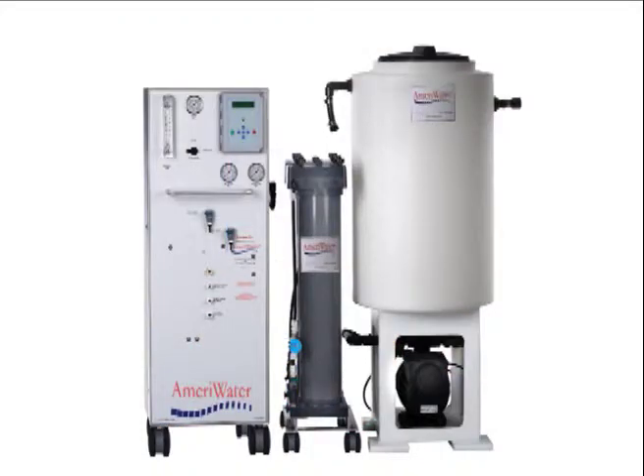AmeriWater's High Purity Water System for central sterile services is easy to install, simple to operate, and easy to maintain.